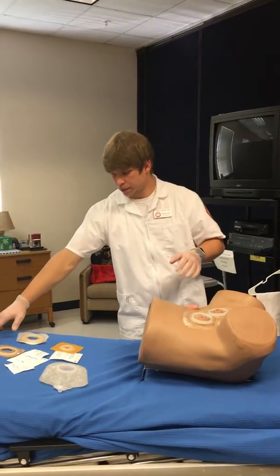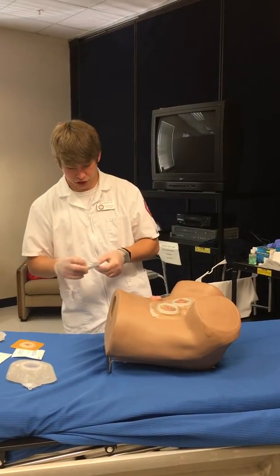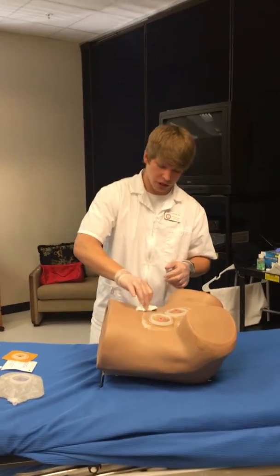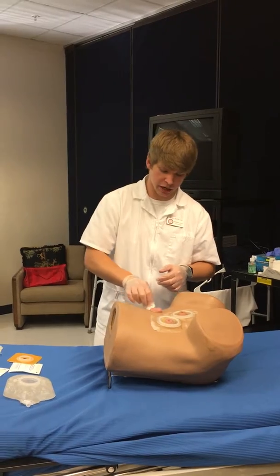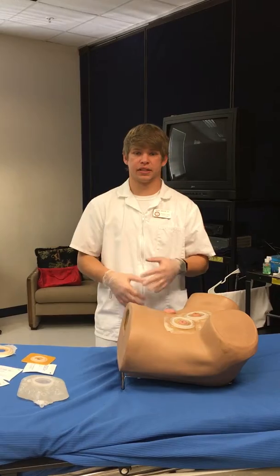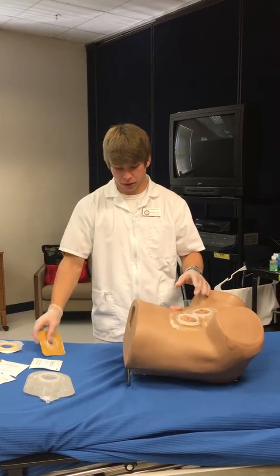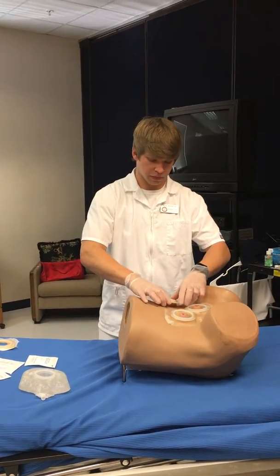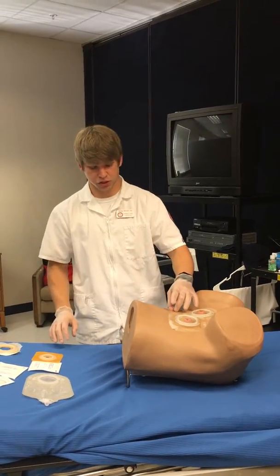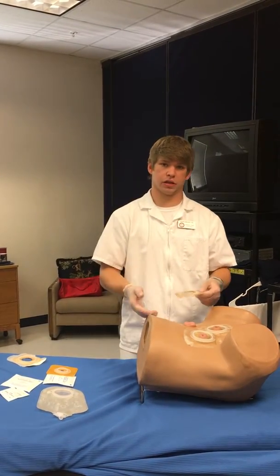Go measure the old bag, discard it, and everything. Then come back and use a gauze to clean the outside area of the stoma. If there's any feces or any paste left on it, clean it, but don't be too rough and irritate the skin, as that could cause more irritation and problems. Next, get a new stoma, measure it, cut it out — you want it to be about one eighth of an inch from the stoma, as tight a fit as possible so no feces leak out around it.